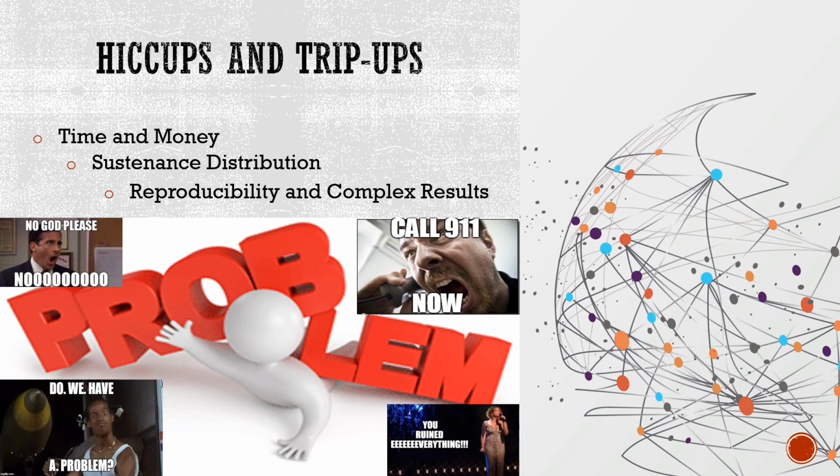As with any other budding technology, there are still some kinks in 3D culturing that have yet to be worked out. The first of which being the financial investment needed to conduct these procedures. When compared to conventional 2D models, the materials needed to carry out and maintain 3D cultures are significantly more expensive. These materials are also harder to come by because there are fewer commercial vendors available that offer these products. On top of that, 3D cultures can take longer to proliferate than 2D cells.